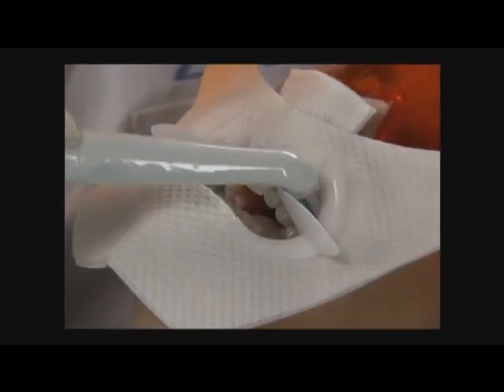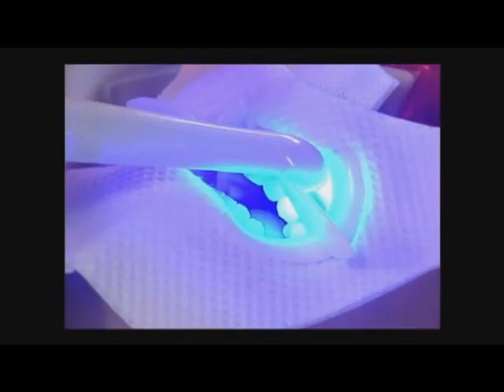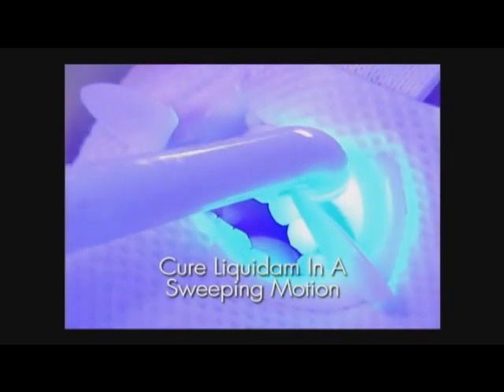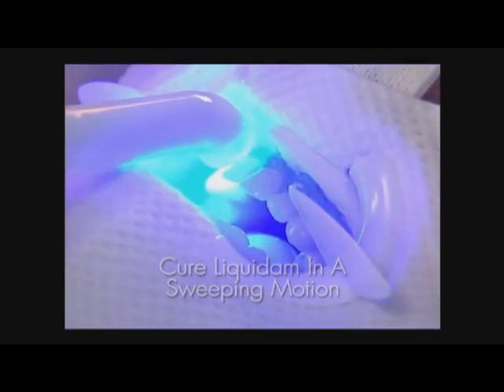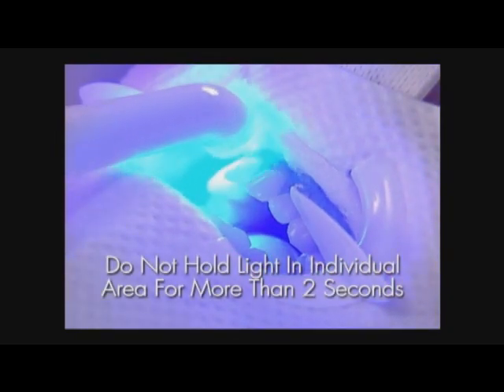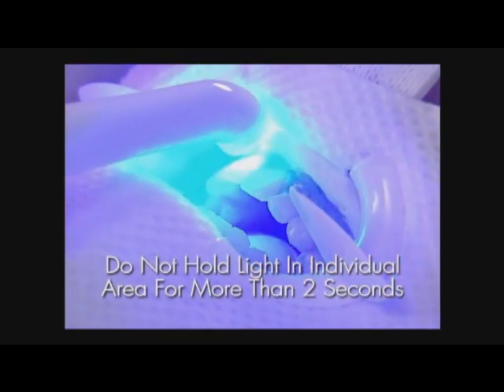Cure the application of Liquidam. Liquidam is a resin blend that can become warm. Therefore, use a sweeping motion when curing, moving the light back and forth across the arch for about 10 seconds. Do not leave the light in an individual area for more than 2 seconds.